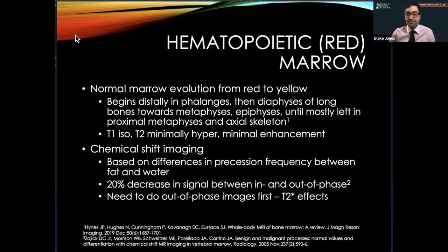Questions? Yeah, I think this is a very challenging topic, marrow imaging and marrow evaluation in general, especially in children who already have a lot of very dense red marrow that's packed in. It's often quite challenging to separate that out from tumor. So this is a very useful technique, and it's very fast. It requires no contrast. And as you said, it has very high sensitivity and specificity if protocoled correctly up front.